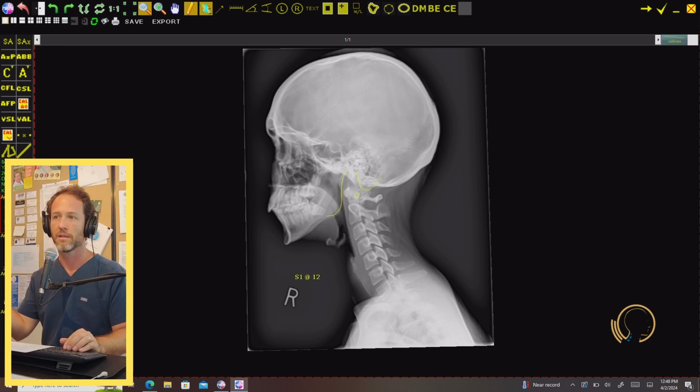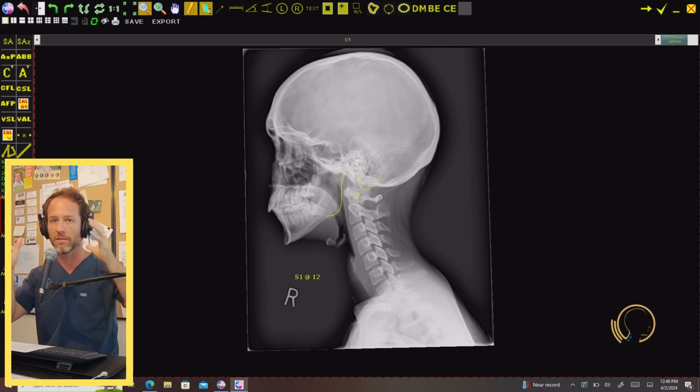So this is your foundational film here, and it's easy to breeze past this and say it's not as interesting as a frontal film, but there are a lot of implications from this sagittal X-ray. And by way of setup, when you set this film up, we're at 46 inches, right, tube to bucky. You are making sure you are aligning that tube and bucky to their head tilt. You're not maneuvering the patient's head.